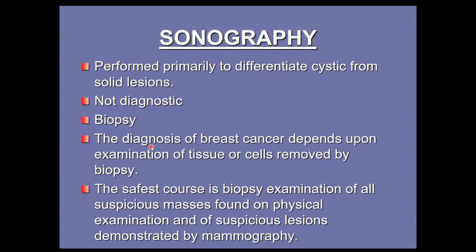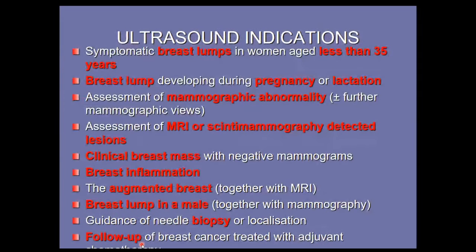Diagnosis of breast cancer depends upon the examination of tissue or cells. We can take biopsy of all suspicious masses on examination and of suspicious findings on mammography. So, in addition to mammography or MRI, we always perform ultrasound along with the mammogram and MRI.